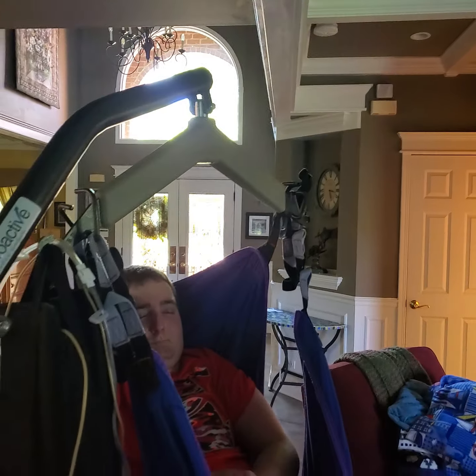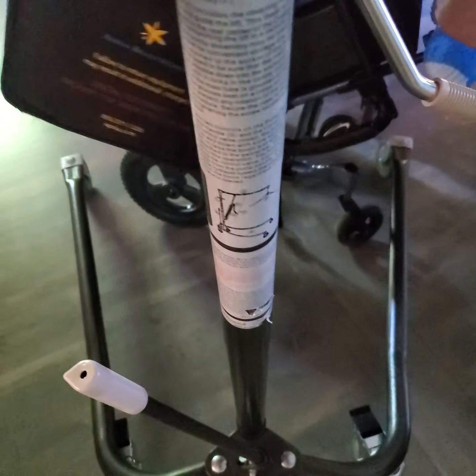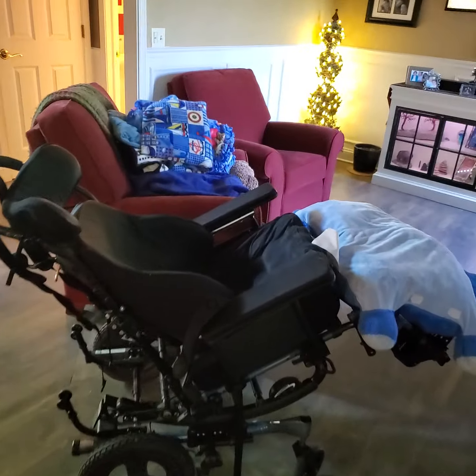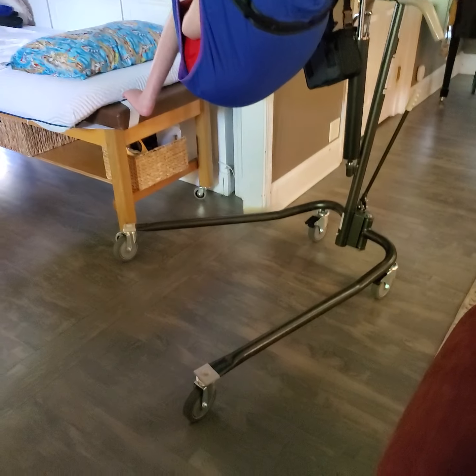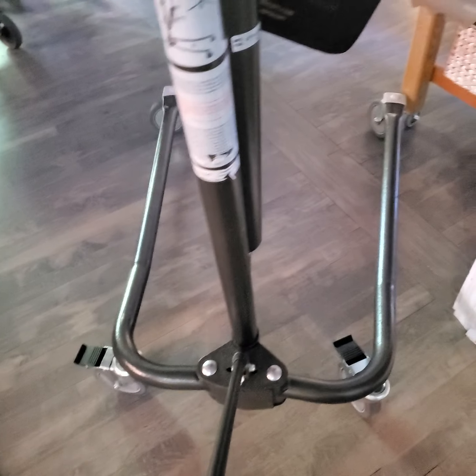Okay, so now I've gone as high as I can go, and you can see down here that it's wider than his wheelchair. So I'm just going to pull back and he will be free of his wheelchair. So you can see now that he is out of his wheelchair. I'm going to pull his wheelchair back so it's out of the way. And then I'm going to make the width of the legs a little smaller. So I'm going to take this handle and bring it in a little bit so you can see that the legs start coming in.